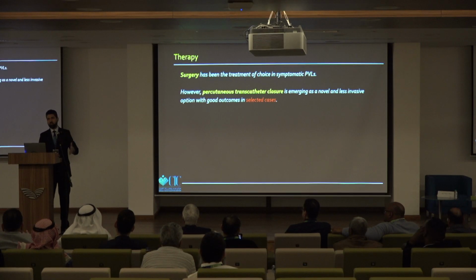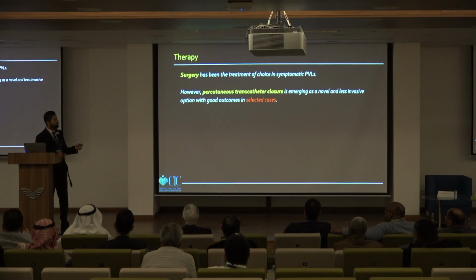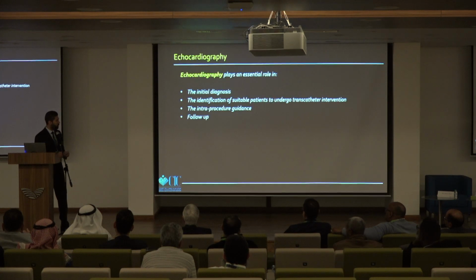Previously, if we have patients with paravalvular leak, whether to leave them alone if they are high surgical risk, or to treat them surgically. But luckily, with the advancement of the interventions and the imaging modalities, I have to say imaging because I'm an imaging guy, we now, for selected patients, can offer them percutaneous therapy. As an echocardiographer, we need to address the patient at many steps.